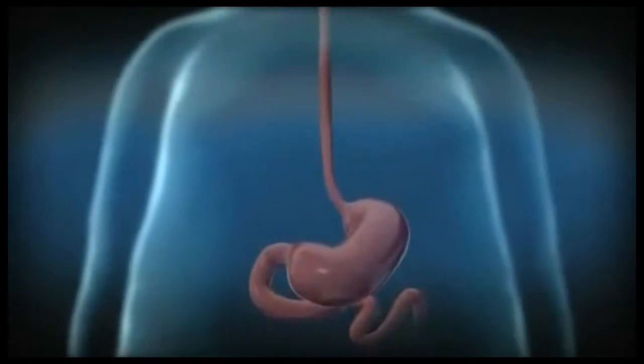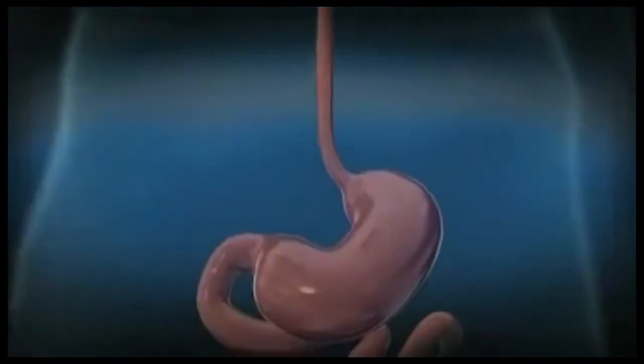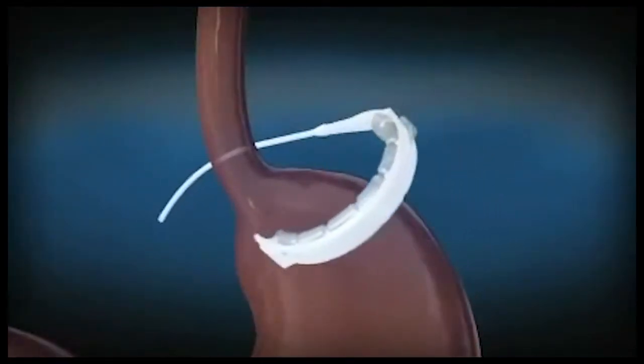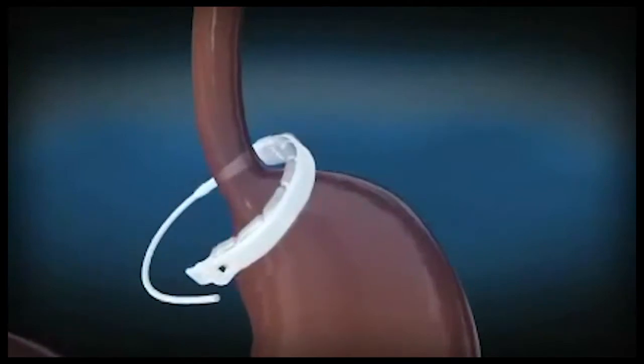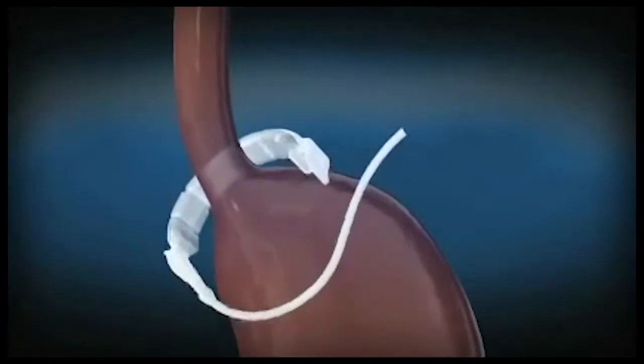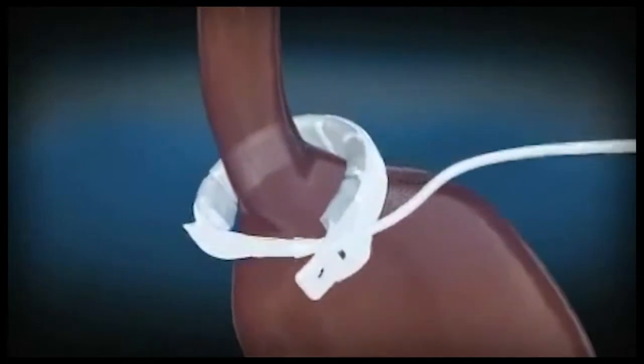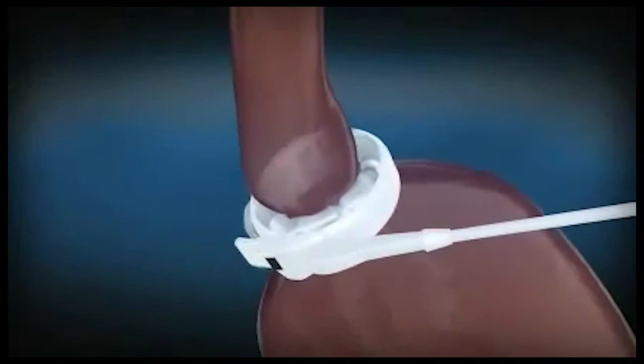The LapBand system surgery is usually performed laparoscopically. The device is inserted through one of five or six small incisions and is wrapped around the upper part of the stomach. This creates a small upper stomach pouch and a narrowed outlet between the new upper pouch and lower stomach.